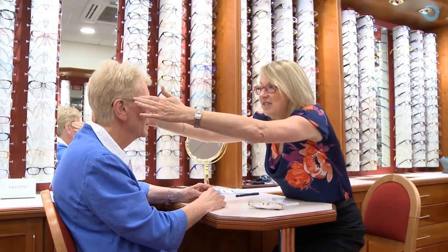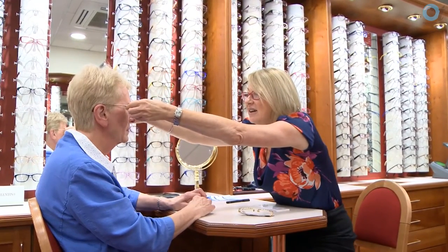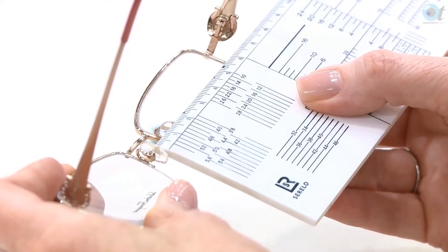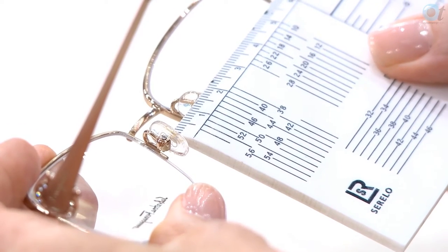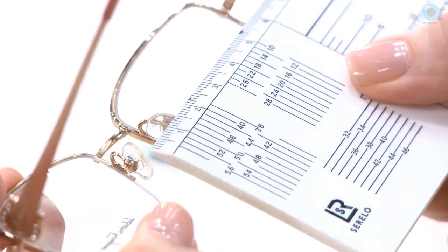My next task is to actually fit the frame. I would check the bridge fitting and make a note of the distance between the pad centres — measuring from the centre of the left pad to the centre of the right pad — and it measures 17 millimetres. This is particularly important when measuring progressives in a metal frame, because if those pads are moved out of shape, the patient won't be looking through the right part of the lenses and could have difficulty with distance or near vision. So when the patient comes back and complains they can't see properly, I can check the record card for the distance between pad centres instead of marking the lenses up all over again.